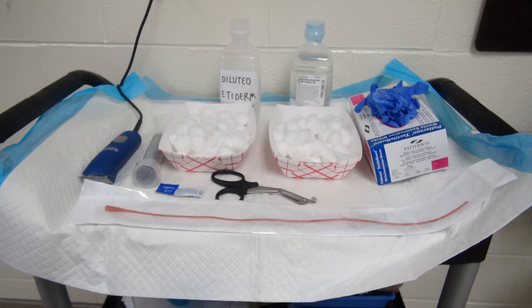You only need maybe six of each. Additional supplies include clippers, a 60cc catheter tip syringe, a packet of sterile lubricant, scissors, a 22-inch 8-French red rubber catheter, and clean examination gloves.